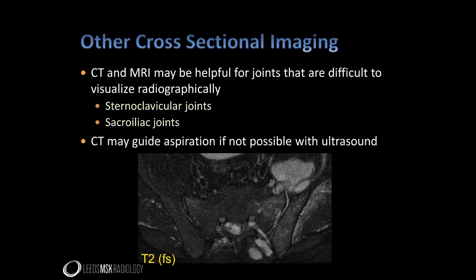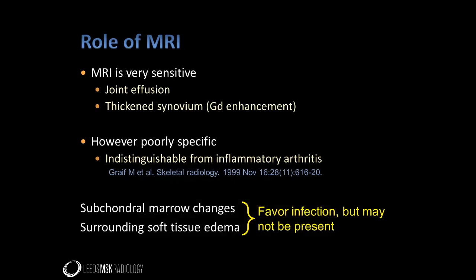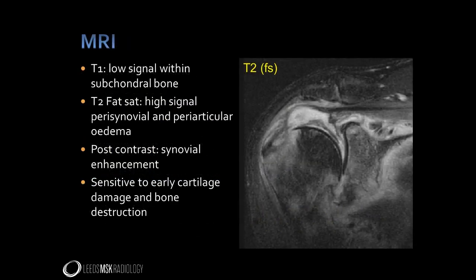CT and MRI can be very helpful when joints are difficult to visualise radiographically, such as the sternoclavicular and sacroiliac joints. This MRI study demonstrates septic arthritis in the left sacroiliac joint. CT is also helpful for guiding aspiration where a joint is not amenable to ultrasound guidance. MRI is very sensitive for the demonstration of joint infection; however, it is very non-specific and particularly poor at distinguishing joint sepsis from other causes of joint inflammation such as rheumatoid arthritis. The presence of subchondral marrow changes and surrounding soft tissue oedema favour infection, but may not be present. In septic arthritis, MRI typically shows subchondral oedema with low T1 signal and increased T2 signal, and we can also appreciate marked periarticular oedema and early erosive change in the bone.